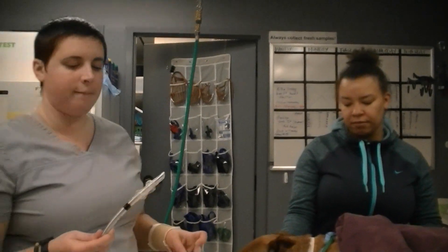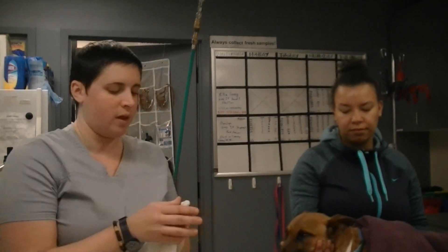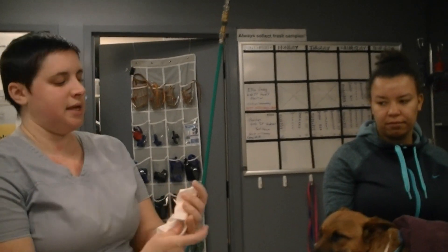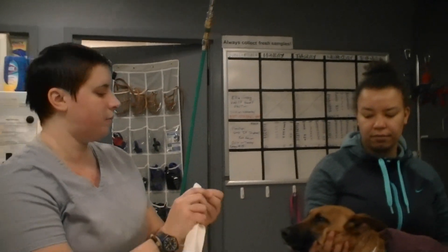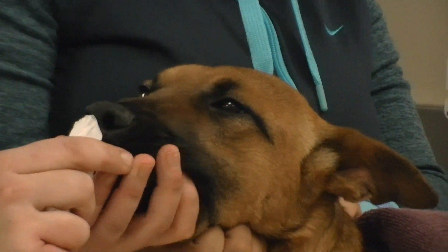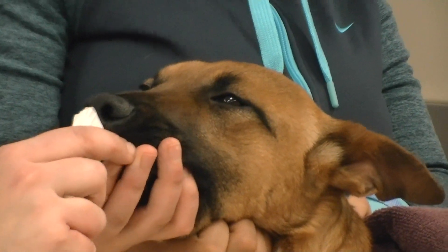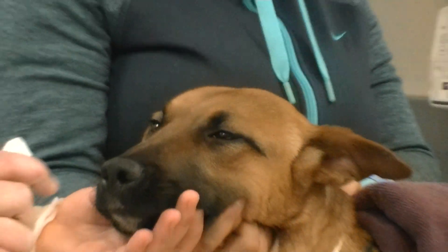There are two places we're going to measure. I'm going to cover the end of my tube with this paper towel because I don't want to contaminate it since it has to go in her trachea. I'm going to see how the width measures up to the space between her nares. This is just a common little trick, and it looks like it might be slightly big there. This can be deceiving — for some animals this trick doesn't work too well.